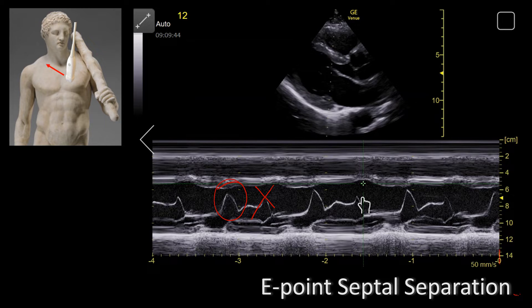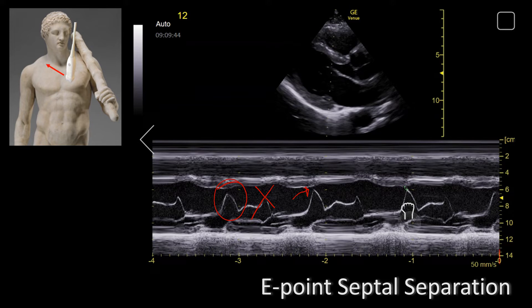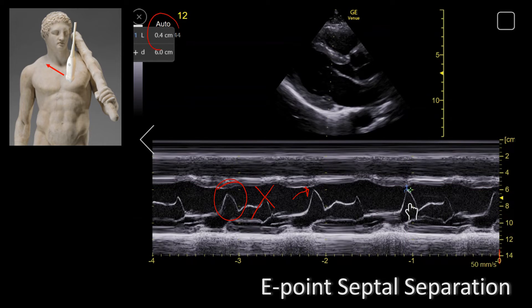If the mitral valve touches the septum, that is great, that is normal, and you don't have to do anything about it. But if the E-wave doesn't fully touch the septum, just like it's shown here, then you have to measure the distance between the septum and the tip of the E-wave, just like it's shown here. So in this patient, the distance between the E-point and the septum is 4 millimeters.